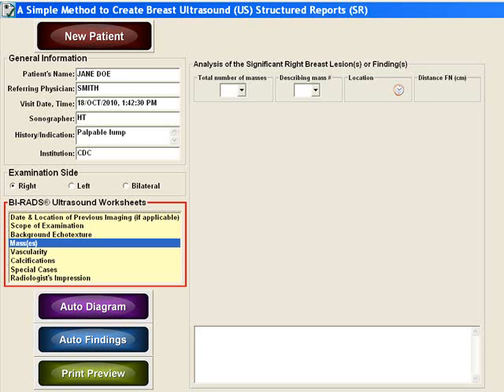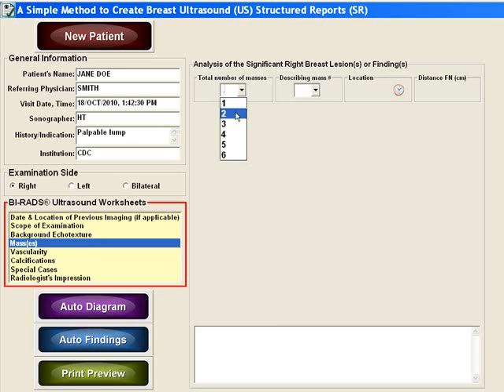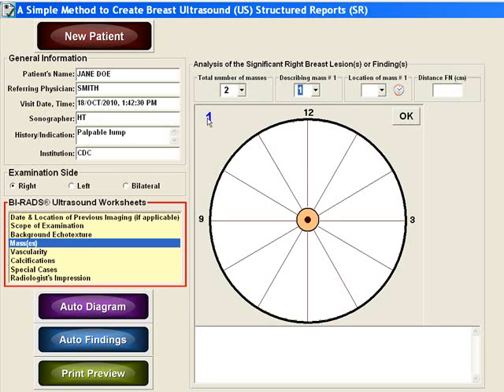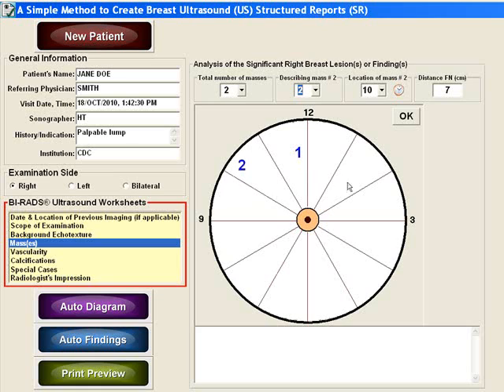In this next step, you will describe the location of any masses that are present. Let's assume that there are two masses relevant in this study. Click the number one to indicate the location of the first mass, and then click number two to move to where it's located. As you do this, it will change the clock face and the distance from the nipple in the report.